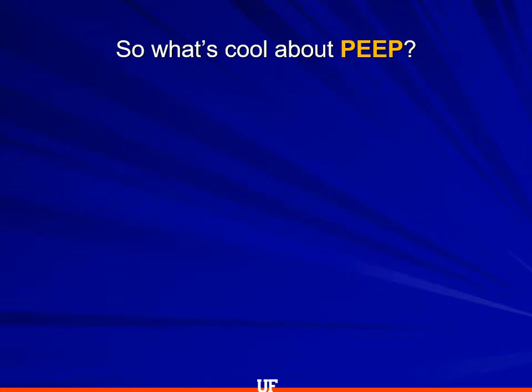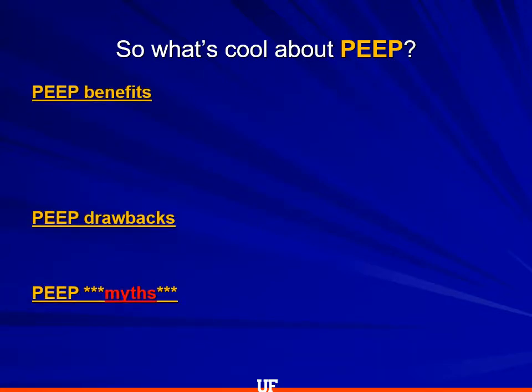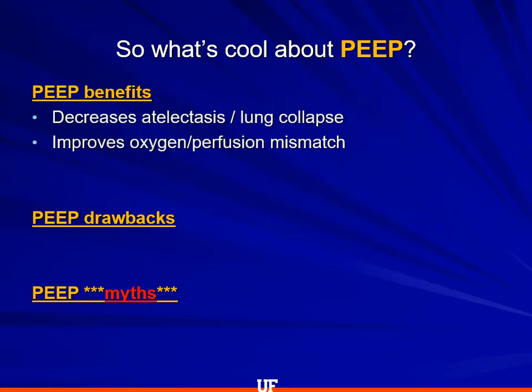PEEP often gets a bad rap, which is really unfair because there are a lot of benefits of PEEP. There's one drawback, and there's one big fat myth. The benefits of PEEP are, by keeping a little extra air and a little extra pressure in the lungs at the end of exhalation, it opens up parts of the lungs that wouldn't have previously been open. And by doing so, it increases the amount of gas exchange, the amount of oxygen that those lungs are able to transmit to the blood by keeping those parts open. And like the balloon analogy, by keeping extra parts open and keeping the lungs a little bit inflated, it makes breathing effort easier for the patient on the vent.